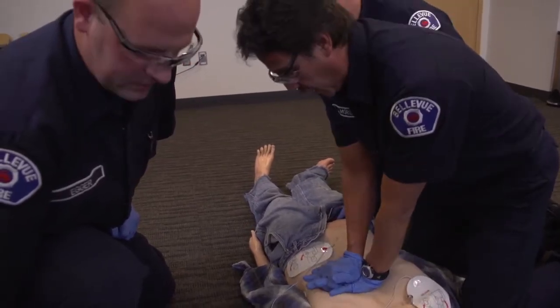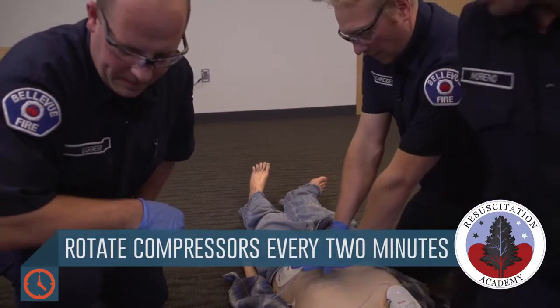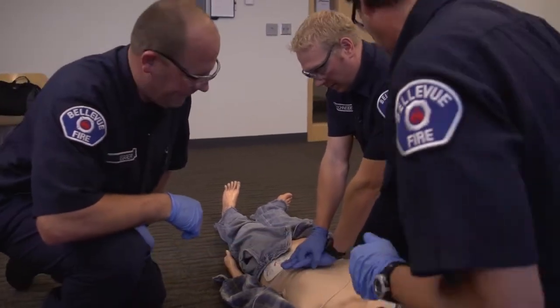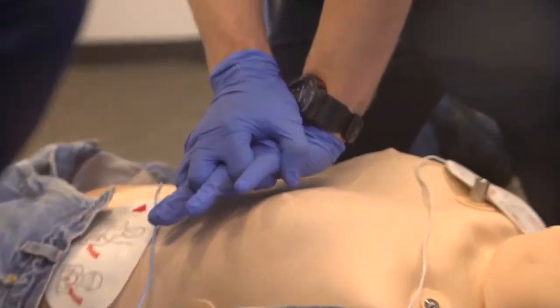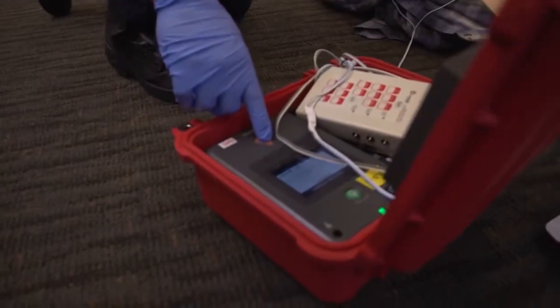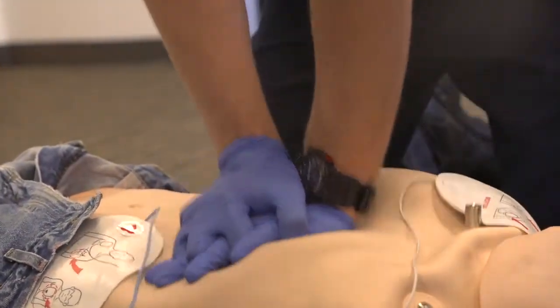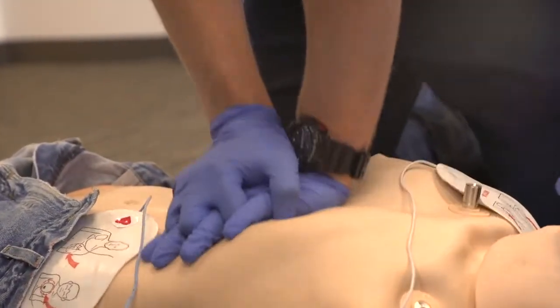26, 27, 28, 29, 30. Hover. Stay clear of patient. Analyzing. Hover. Shock advised. Stay clear of patient. Deliver shock. Shock delivered. Continue CPR. Begin CPR.